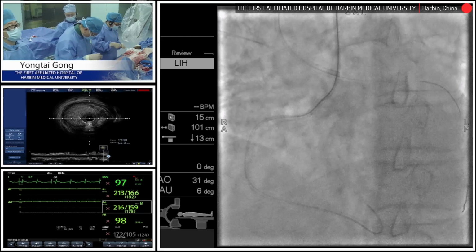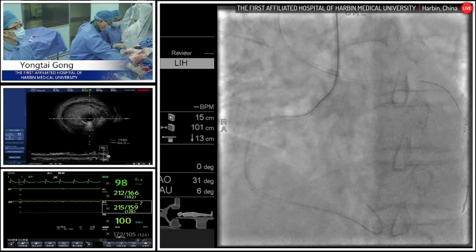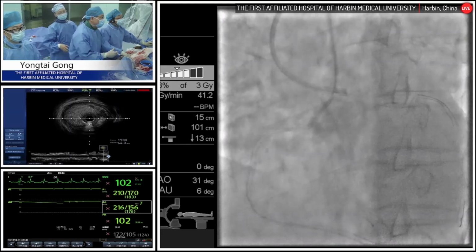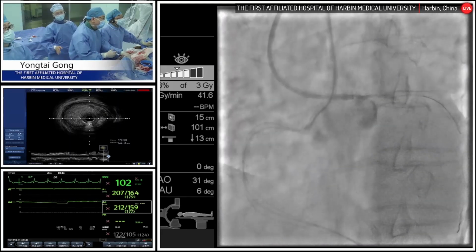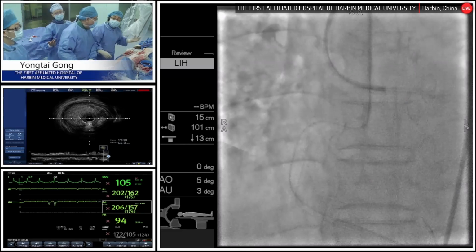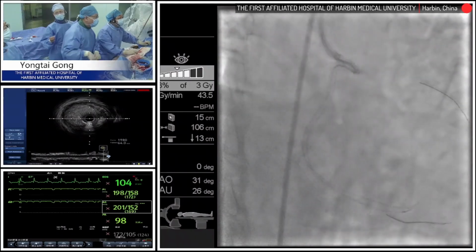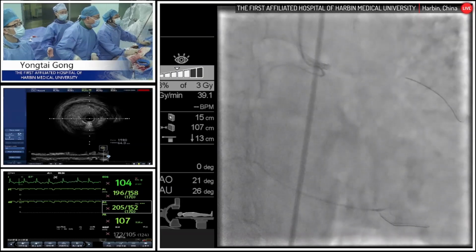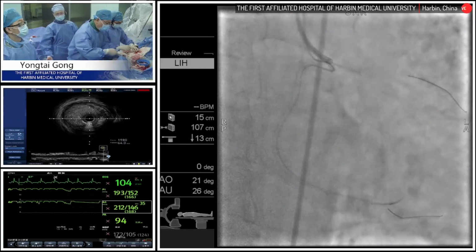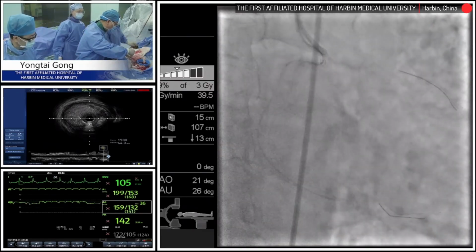And finally, what are the risks of trying the antegrade approach in this patient? We explained during our demonstration that in this antegrade attempt, there is no clear identification or hint of which direction should be punctured. There are also ramus and circumflex branches; this is a trifurcation. If you cannot make the right puncture, it's highly likely the very stiff antegrade wire goes into the subintimal space, which we want to avoid. A severe hematoma or dissection from the antegrade side is a strong indicator of antegrade failure, and may cause severe damage to the circ or ramus.